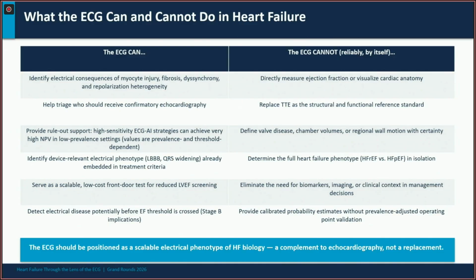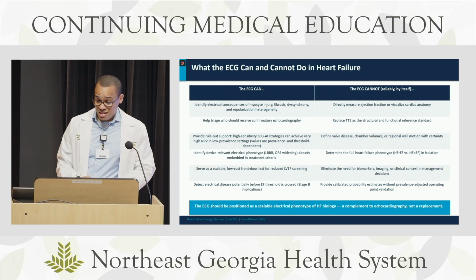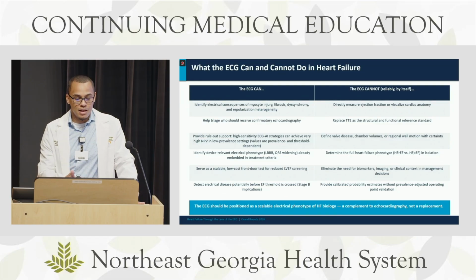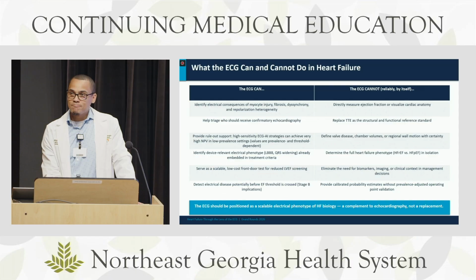But I don't think we are there yet. I think there's a lot of room for improvement with this technology, but it's very promising. Obviously, EKGs can never replace an echo, but I believe they can complement it. The way I see it, it's complemented by characterizing this electrical remodeling, because a lot of our therapies are tailored for the problems that electrical remodeling is causing.